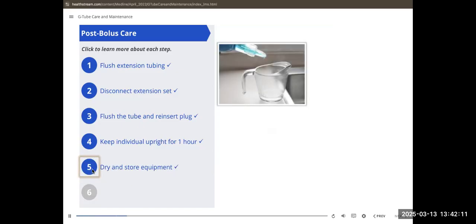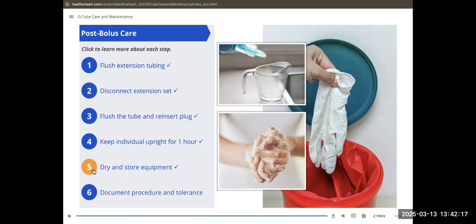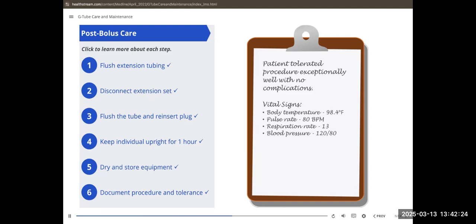Always clean, dry, and store your equipment after use. Doff gloves and perform hand hygiene. Lastly, be sure to document the procedure and the tolerance of the bolus feeding.